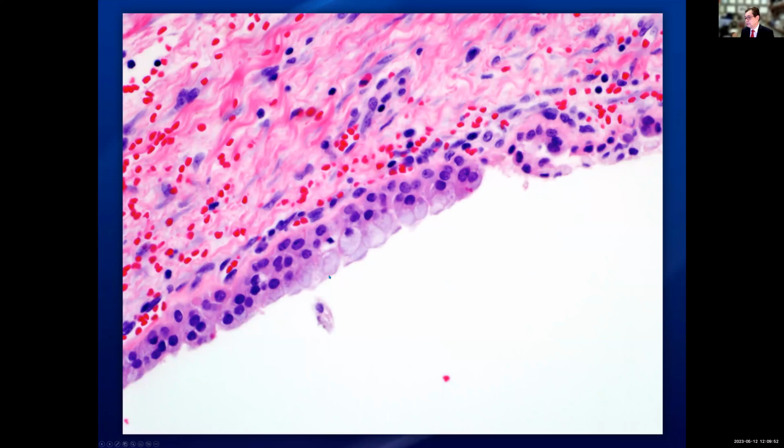mucocytes. Whenever you see mucocytes, there are two possibilities. One is mucinous metaplasia. The other possibility is mucoepidermal carcinoma. So I want to emphasize that you have to rule out a low-grade mucoepidermal carcinoma. And again, you have a more mucinous differentiation. And here I want to emphasize that mucinous differentiation does not mean you see mucin in the stroma. That doesn't count. You have to see the mucin within the cytoplasm in order for us to call it a mucocyte.